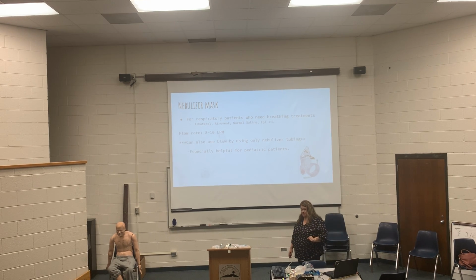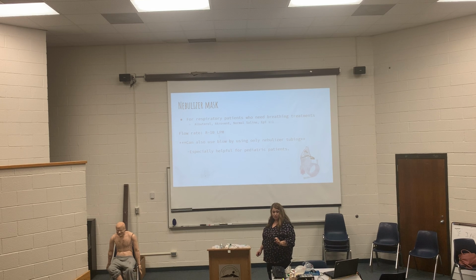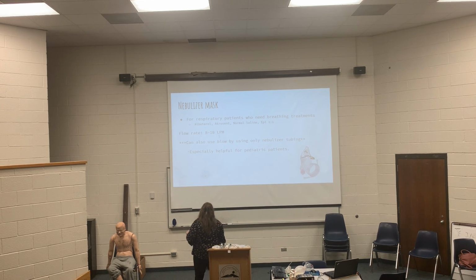Nebulizer mask. Has anybody ever used a nebulizer mask before? My daughter has had to use them whenever she gets sick.